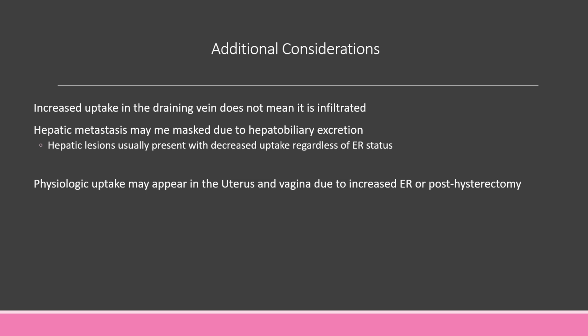Some additional considerations for FES studies. Increased uptake in the draining vein does not mean that it was infiltrated. This is a very important point to make. Sometimes there is activity that is seen in the vein, the draining vein. That does not mean that it is an infiltration. It does not mean that there are consequential health effects for that patient. So it is normal to see some of that activity there, but that is why it is extremely important to inject it slow over 1 to 2 minutes and then flush it really, really well.